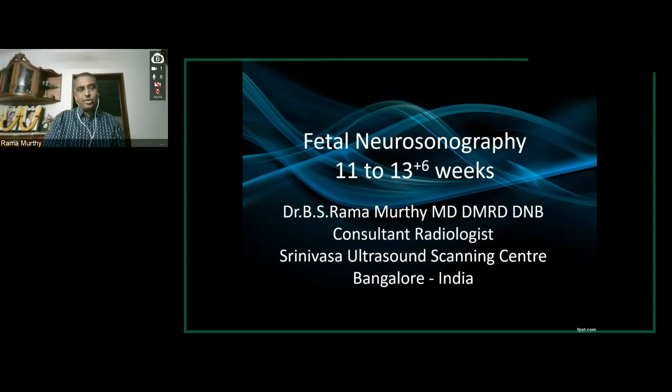Thank you, Madam Zeenath. Thank you, Team GE, and welcome participants for this evening's webinar. We will be dealing with the fetal CNS in the 11 to 13 weeks, 6 days period. Now, we all know that the 11 to 13 weeks, 6 days scan has come to stay. It's a part of standard obstetric care, and therefore this window provides us an excellent opportunity not only to look at the viability of the fetus, not only to look at the number, the volume, the markers of aneuploidy, markers of preeclampsia, and so on, but it gives us a wonderful opportunity to look at fetal anatomy as early as 11 to 13 weeks and 6 days.